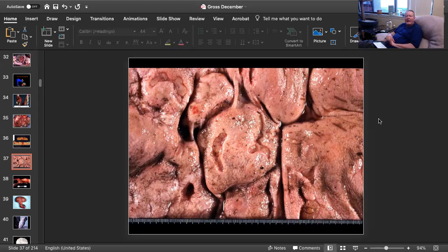Well, this is a difficult one. We are up so close and personal, but we are in the abomasum. These are actually the abomasal folds. It's tough to really recognize them. And then we have these large ulcers. These abomasal folds are massively thickened by the influx of neoplastic lymphocytes.